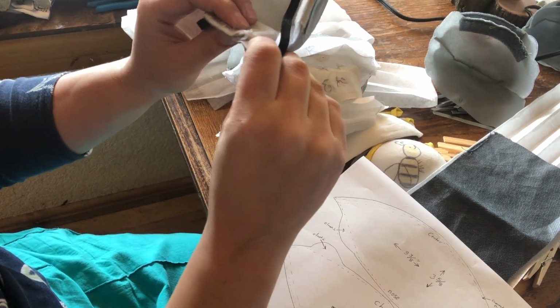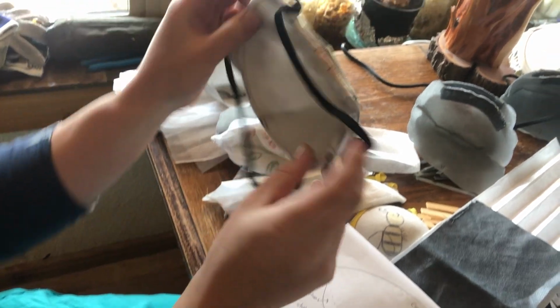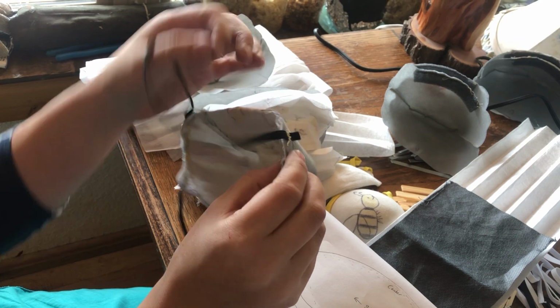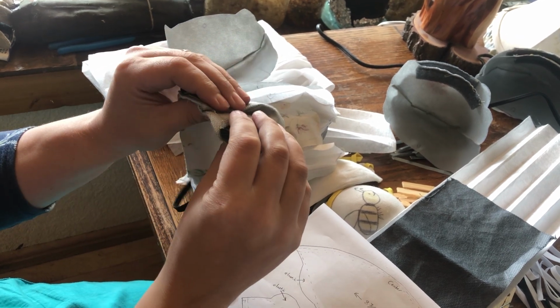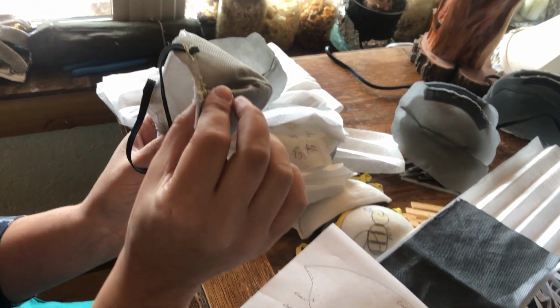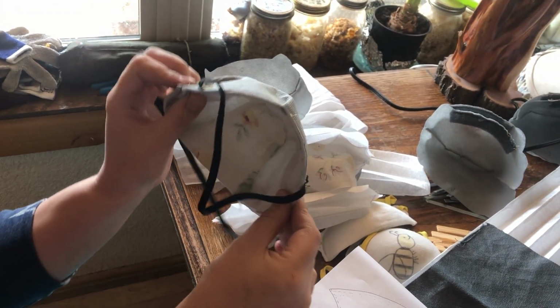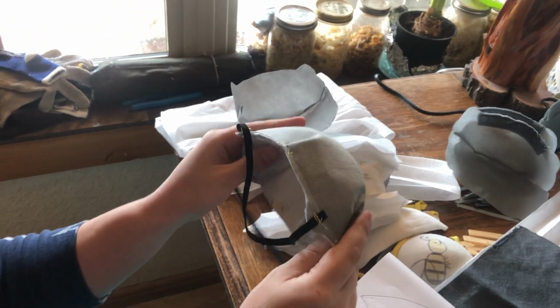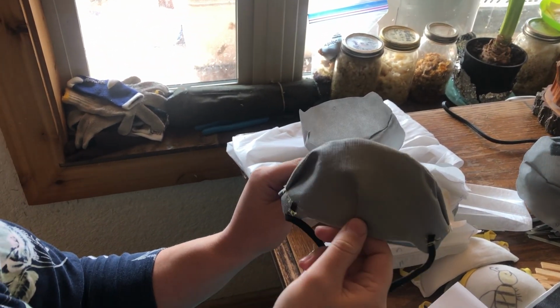I made pleats in the sides because it was just a little bit squishy. It was smashing my nose. So I made pleats in the sides, just evenly on the sides, and that's anywhere from probably about a 3/8 pleat there on the sides of this. I did not mark that on my pattern. Okay, so this pleat was not in the bottom, right?